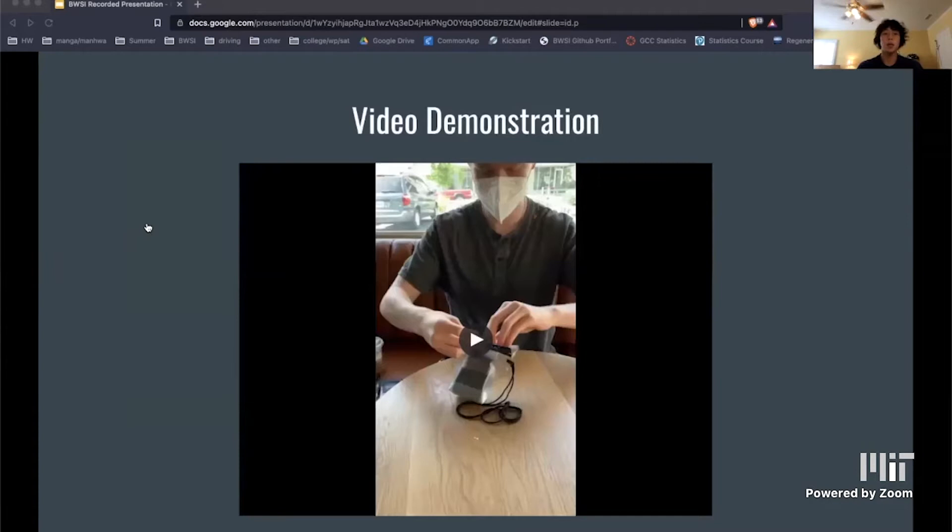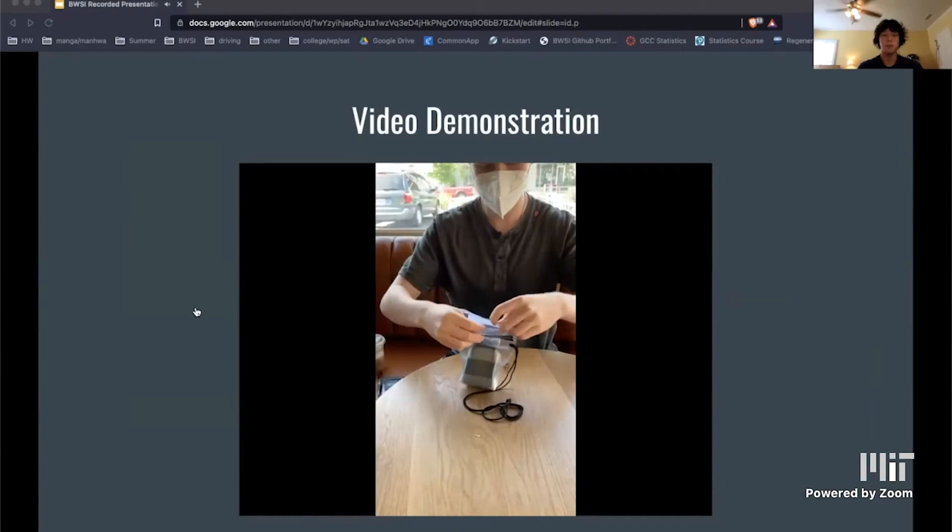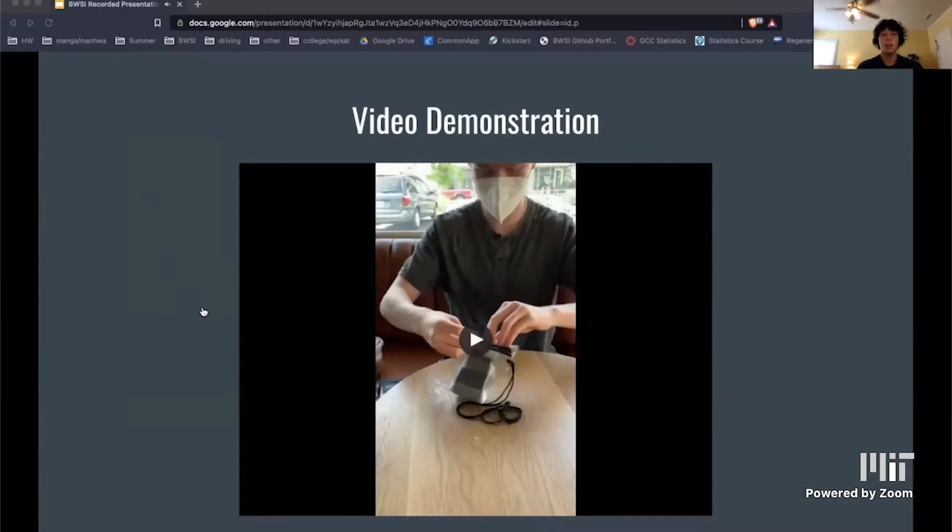Here's a video demonstration of my co-designer putting the insulin pump into the product. You can see that it only took him around 10 seconds to put it in and close the bag.